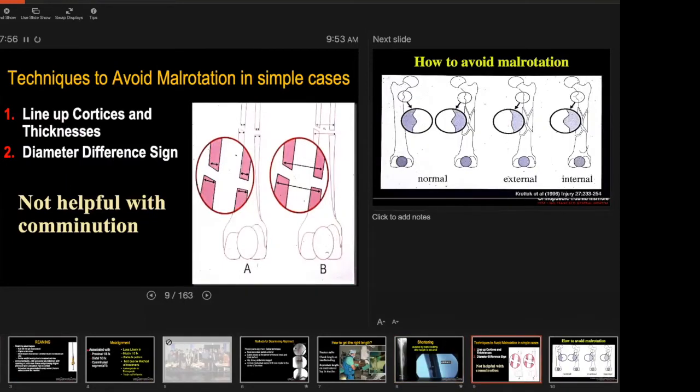Some techniques to avoid malrotation in simple cases: you can line up the cortices and thicknesses and look at them on AP and lateral view, and you can also look at the diameter. Those are the two very simple ways of doing it. However, it's not helpful with comminution.